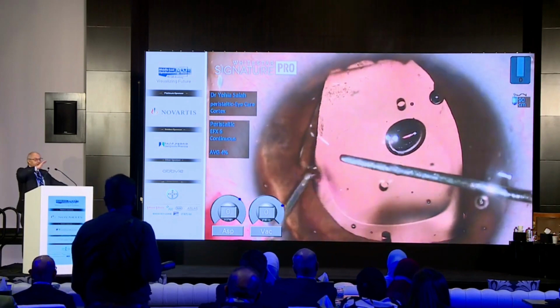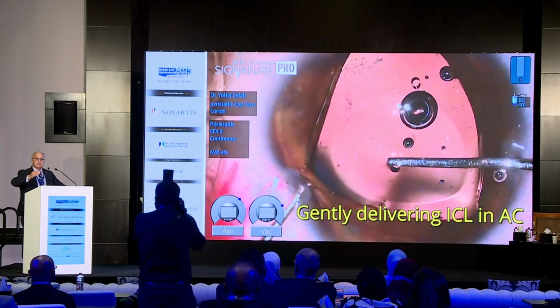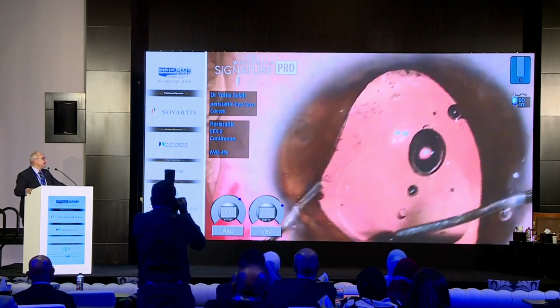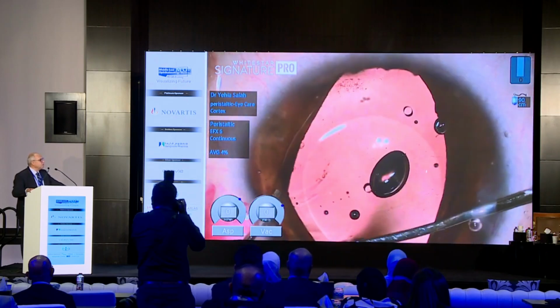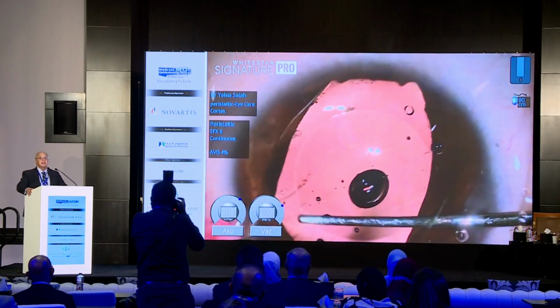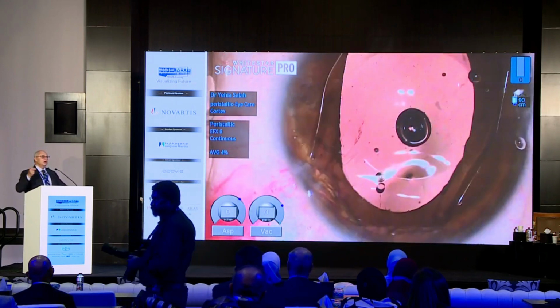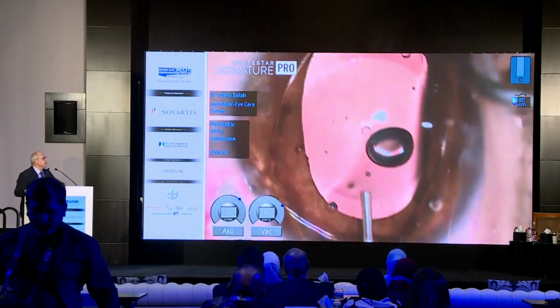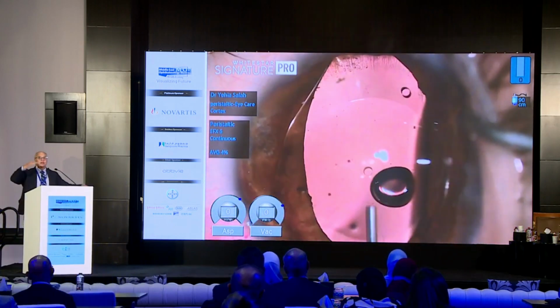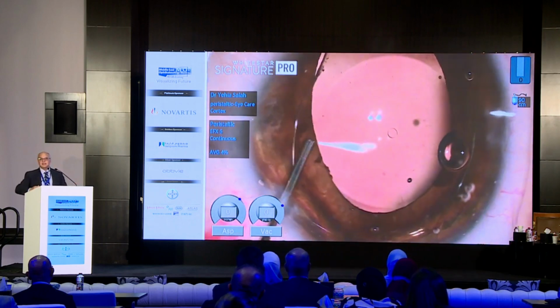Preferably, you should also inject a viscoadhesive in the anterior chamber to protect the corneal endothelium, to have a film protecting it. All the maneuvers are carefully made, and you have always to make sure that you are aware of the position of the lens and the anterior capsule and aware of the cornea. So you are working and thinking in all different dimensions.